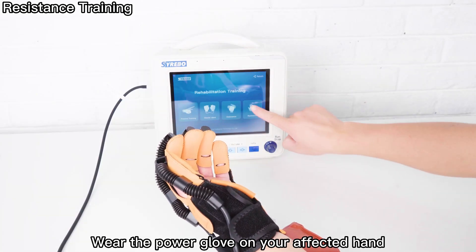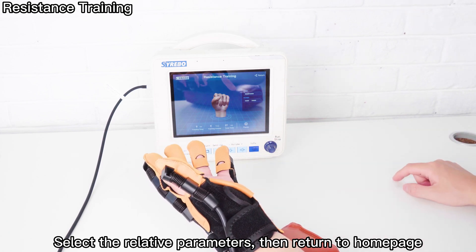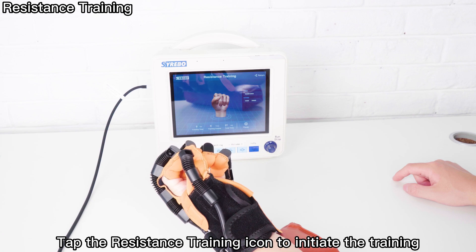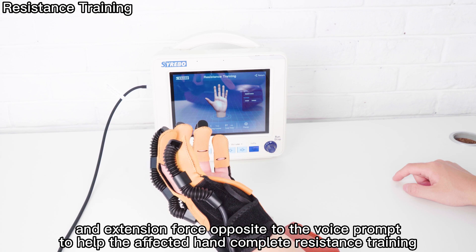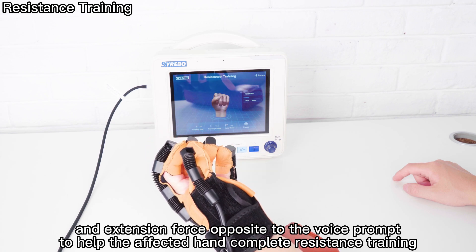Wear the Power Glove on your affected hand. Select the relative parameters, then return to the home page. Tap the resistance training icon to initiate the training. The power glove will drive a flexion and extension force opposite to the voice prompt to help the affected hand complete resistance training.